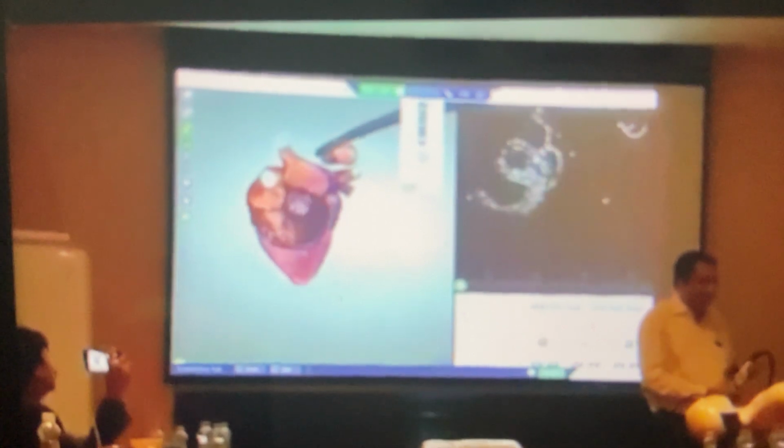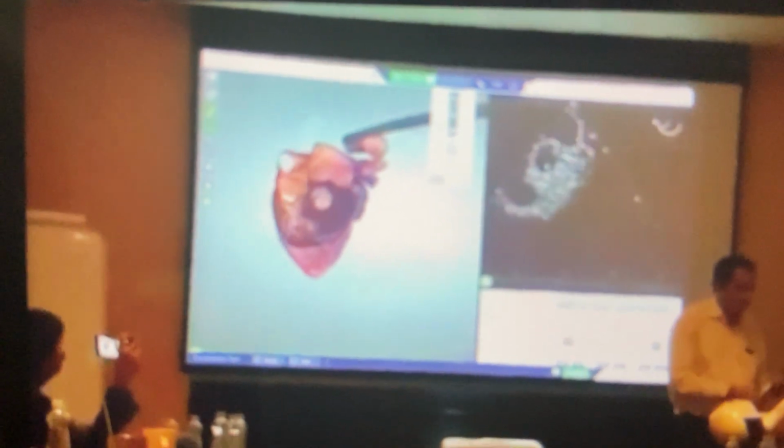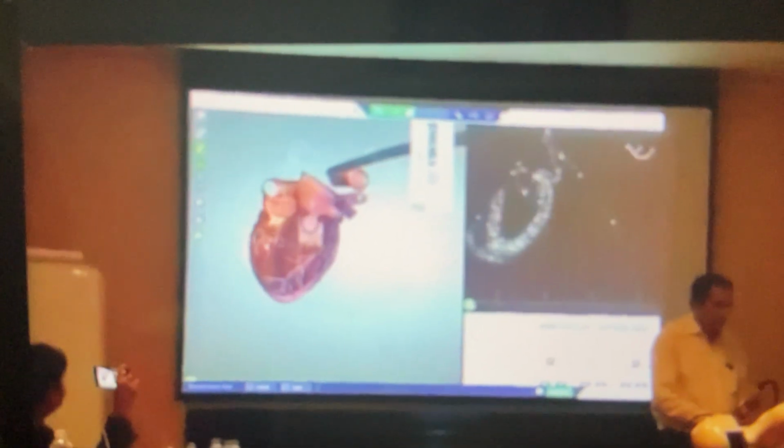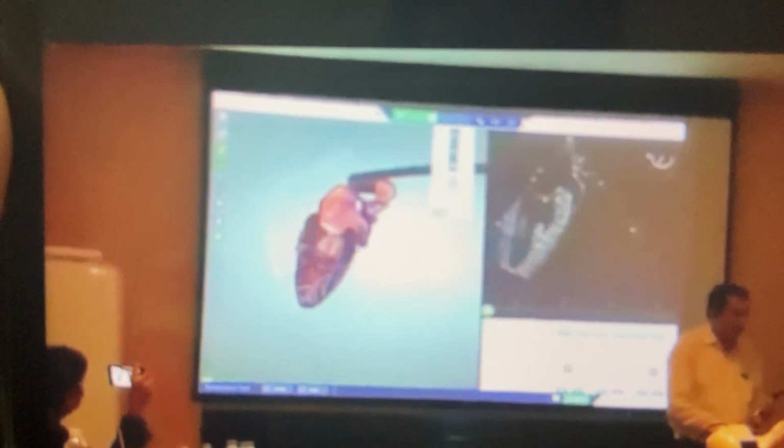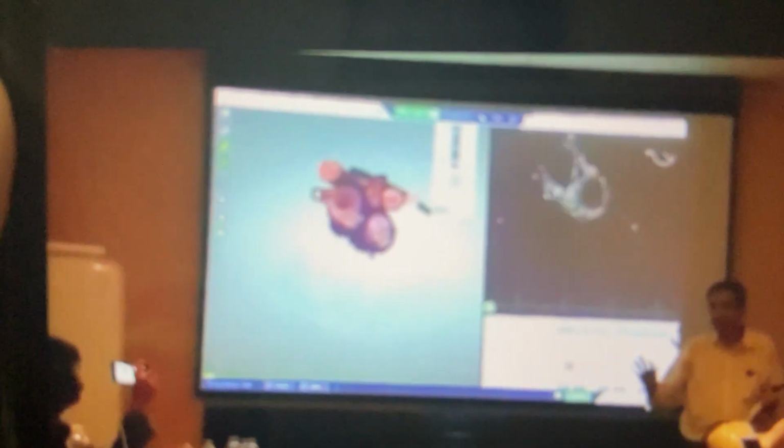I keep the LA appendage in view and slowly increase the angle. So 40, 45, slowly keep on increasing the angle. 50, 60, 70, 80, 85, 90, 95, 100, 125, 130, 140. So right from 35 to 145, 150, you can scan the whole area. Got it? So these are all my left-sided views.